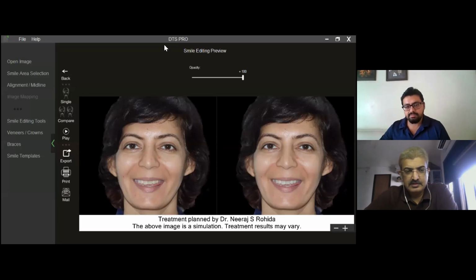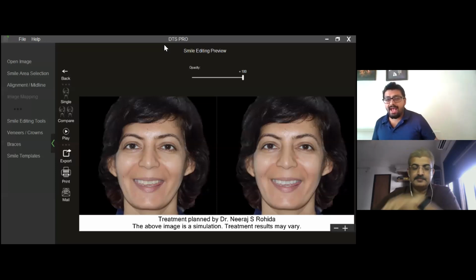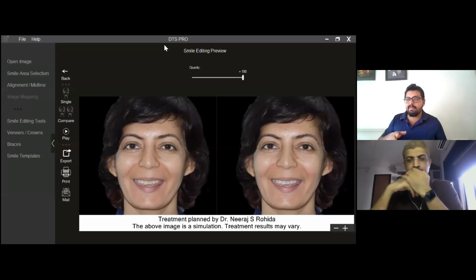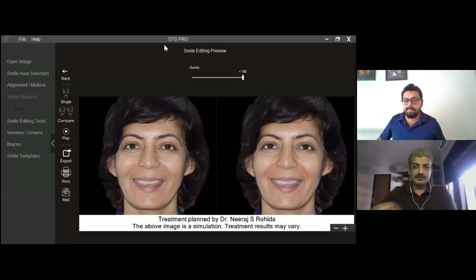So there is a question from Dr. Vijay M. He's asking, can we outsource this process to you for a fee per patient? No, we do not want to do that. The primary reason is, for me it is just photograph editing, so I might very well use just some smile. I can do it in a minute for you, right? We want the dentist to do this, because the dentist has seen the patient. They understand the biology, the physiology, the mental makeup of the patient, and what is their follow-up to the treatment plan. Your treatment plan might vary from another's treatment plan as well. So it is better that person do it on their own.